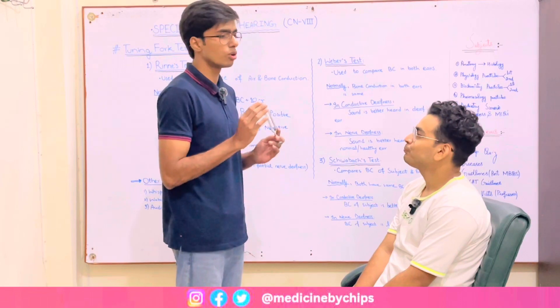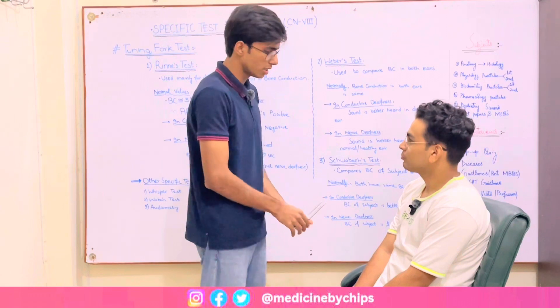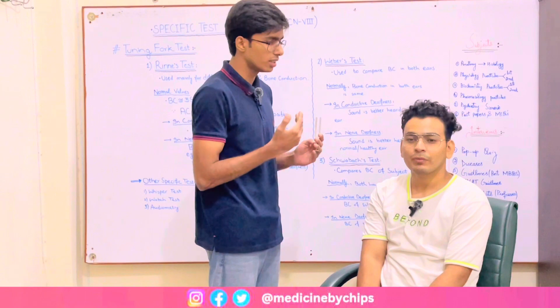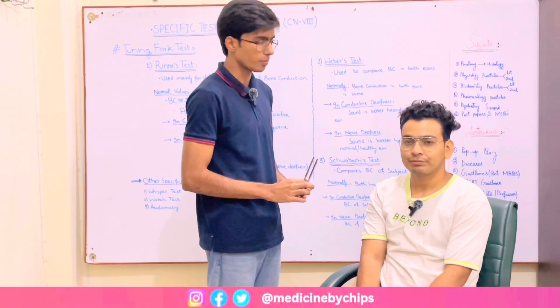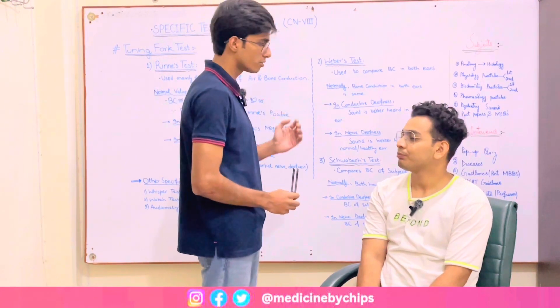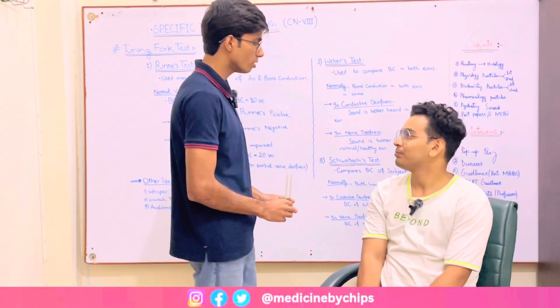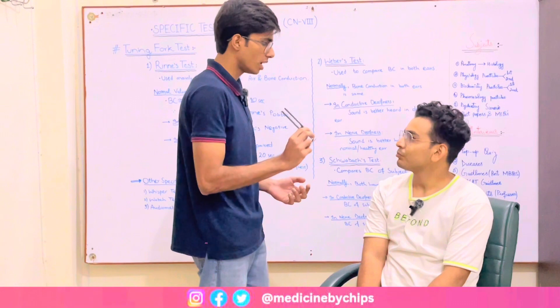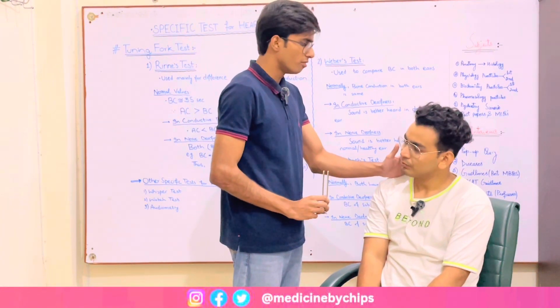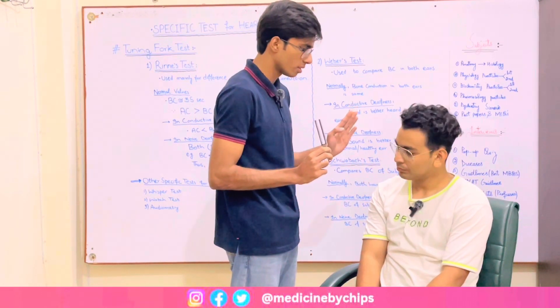Before proceeding, you should know about the basic protocol of approaching a subject. You should approach him from his right side. First offer greetings, take consent, and then perform the procedure. My name is Dr. Bashir Hasan and I am going to conduct your hearing test. Is that comfortable with you? Thank you. I will be placing the tuning fork on your mastoid process here on the back of your ear. When the sound fades away, you will tell me by raising your hand. Okay?